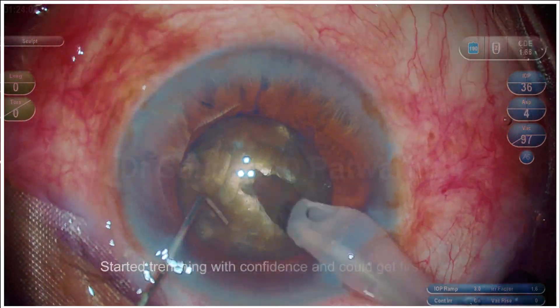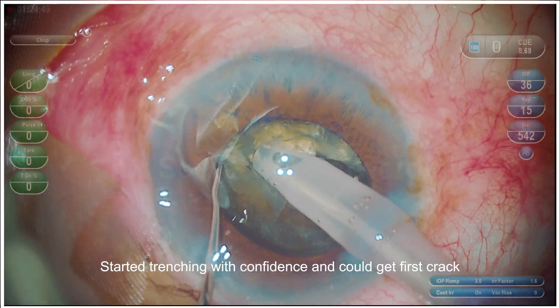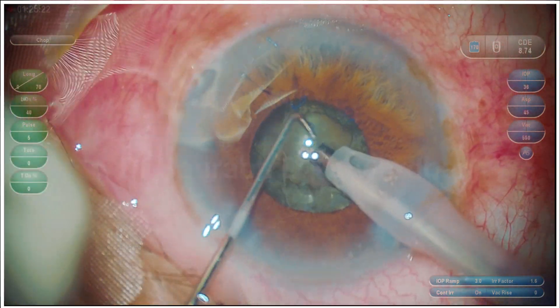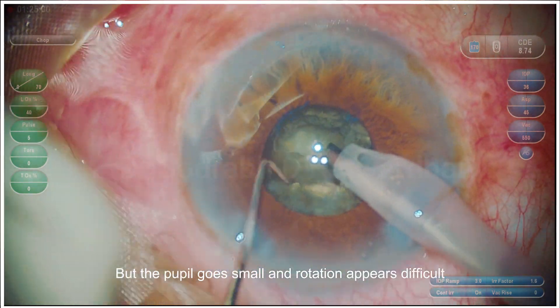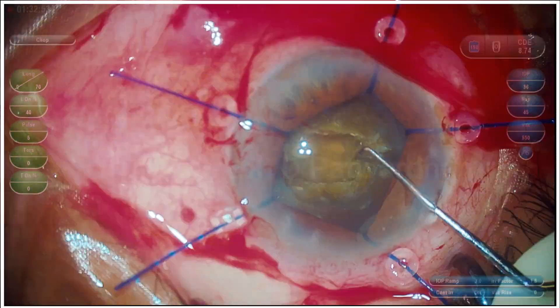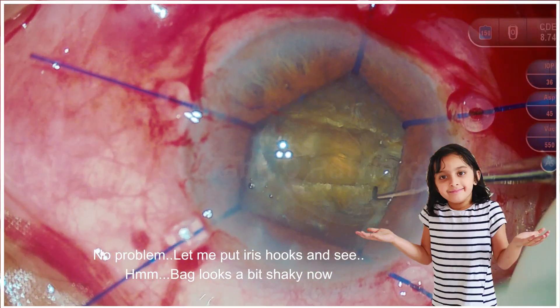So let's go ahead with trenching. The trenching appears good. I do the first chop, I get a crack, and as I try to rotate it further, I find that the pupil goes small and rotation appears difficult. So I put some iris retractors — no problem.